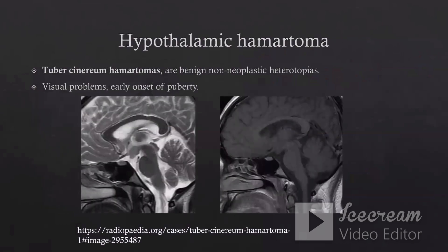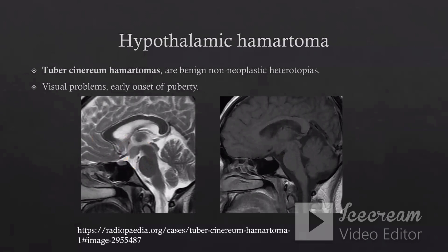One of the most important causes for epilepsy is hypothalamic hamartoma. This is considered as a benign, non-neoplastic heterotopia involving the tuber cinereum, which is a part of the hypothalamus. Most commonly, the patient with hypothalamic hamartoma is complaining of epileptic fits, sometimes associated with visual problems and early onset of puberty. As you see here, we have a well-defined mass involving the tuber cinereum of the hypothalamus. This mass has signal intensity very similar to gray matter — isointense signal in T2, also isointense signal in T1, with no contrast enhancement. It is one of the most important causes for epileptic fits, so we should concentrate on the hypothalamic region as well.